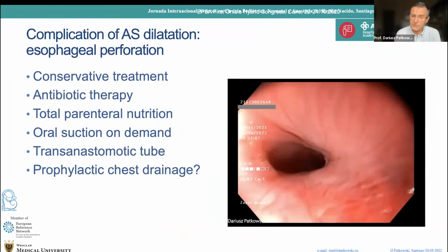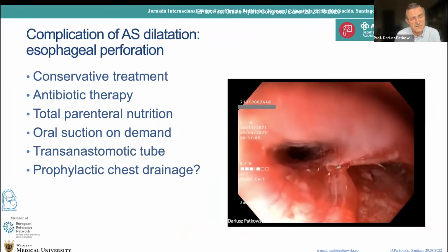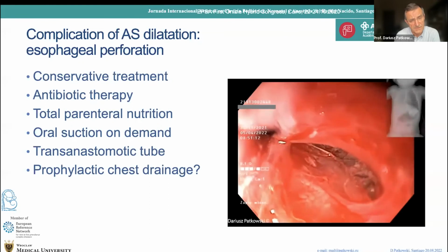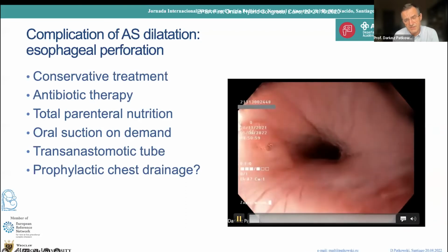And sometimes, unfortunately, there are complications. You can see this is the case. We tried to dilate it without a guide wire. So right now we always use a guide wire. So what to do in such a case?